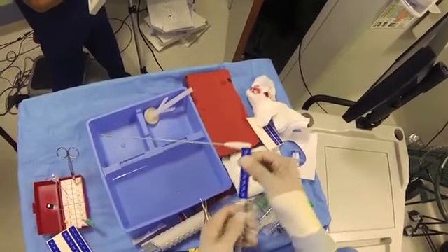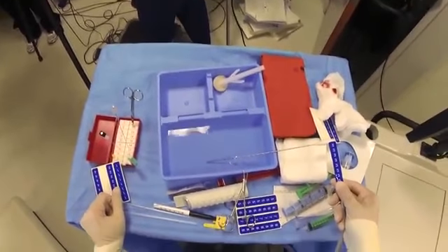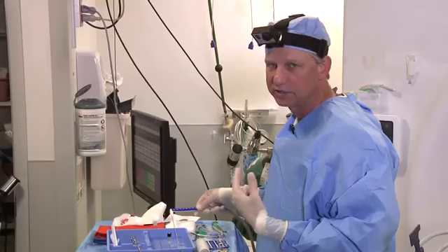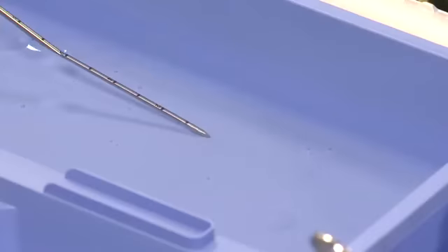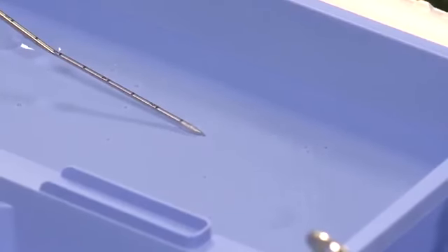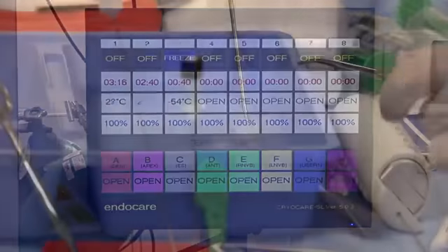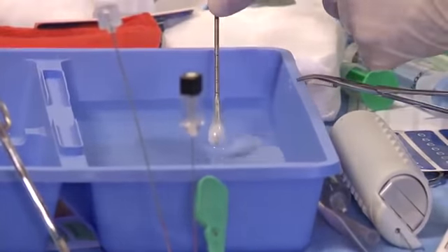Michelle, let's test it. So we're going to run a 90-second helium cycle. This thing on my head, by the way, is not loops, not a light, it's a GoPro. So we've switched to the argon cycle after the 90-second thaw, and we should see an ice ball develop here, again looking for bubbles. We'd like to see it at minus 20 by 20 seconds. 30 seconds. So at 30 seconds, there's no bubbles. The ice is not extended up the shaft.